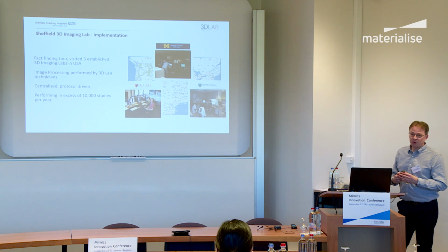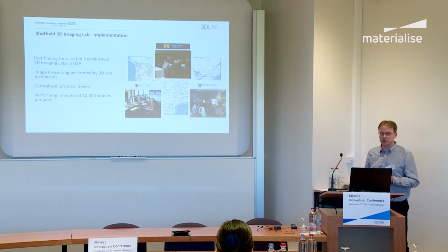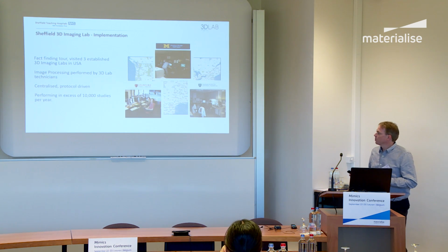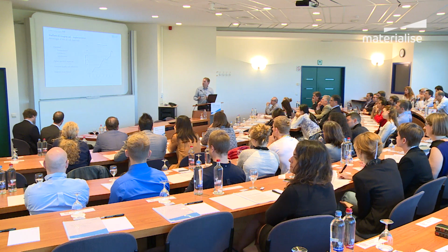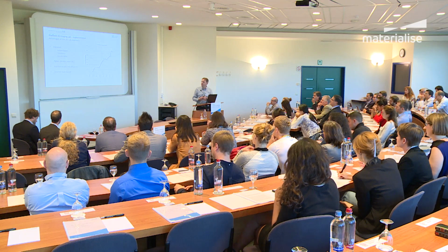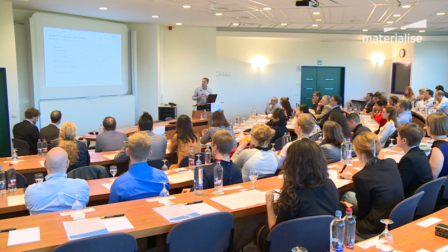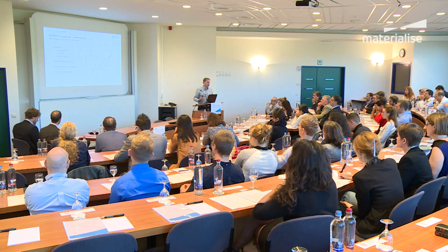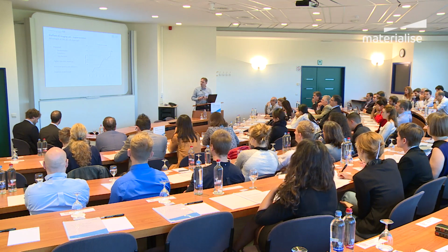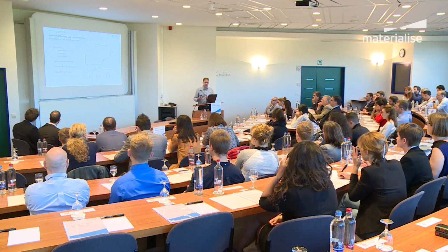But the common approach to all of these labs is a centralized, protocol-driven type of processing, where the processing is being done by 3D lab technologists, or radiographers in our case in the UK. And we brought back those ideas to the UK, and the advantages of doing it in a 3D lab are we get much improved standardization and consistency and reproducibility of our results. And because these people are using the software all the time, we get much higher operator expertise, which leads to improved quality and efficiencies. And we can also target the results to the application.